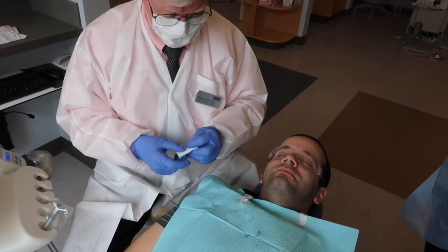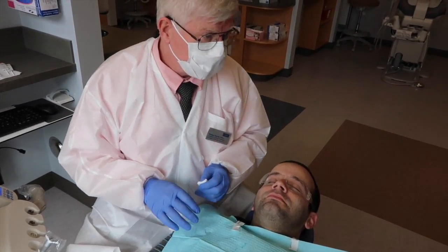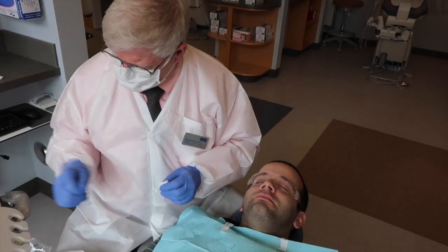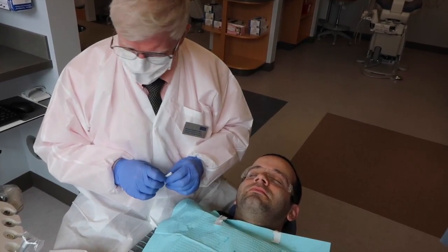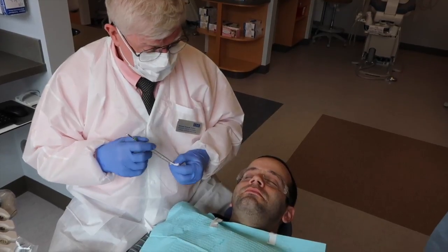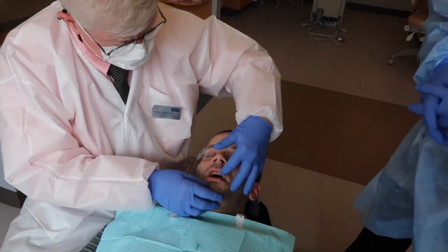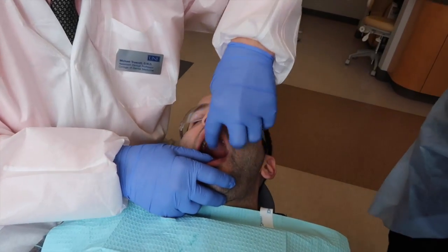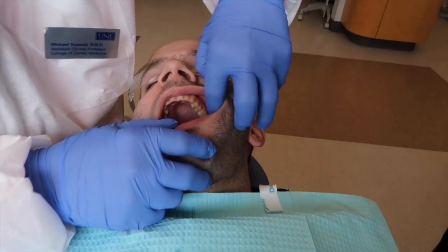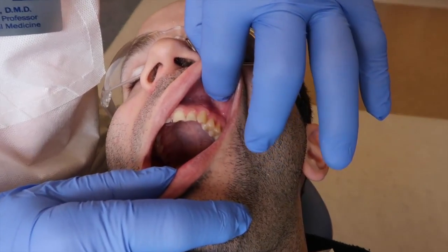Welcome back fellow Cariboudians. We're going to demonstrate simple maxillary infiltration and anesthetize number 12 right in through there.